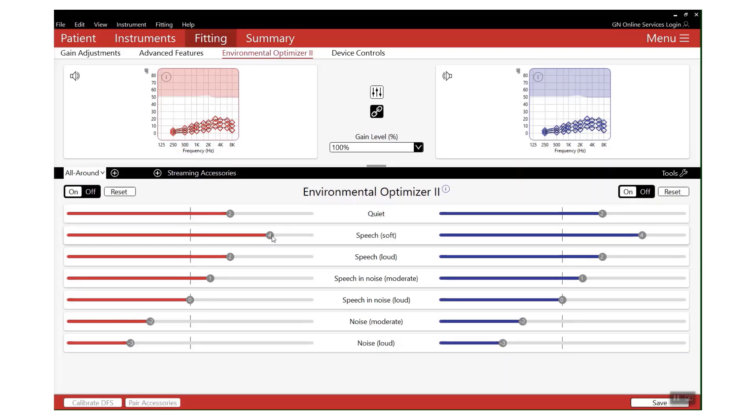To reduce the effect of this, by using Environmental Optimizer 2, specifically adjusting on the soft speech handle that you can see on the screen, it's not going to make any adjustments unless those hearing aids are detecting soft speech. So it's very personal to that patient as to their issue and the solution.